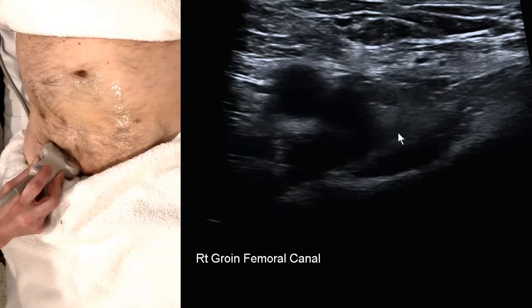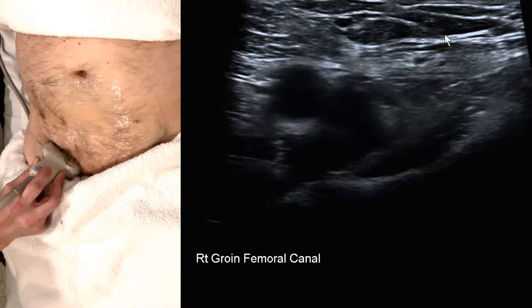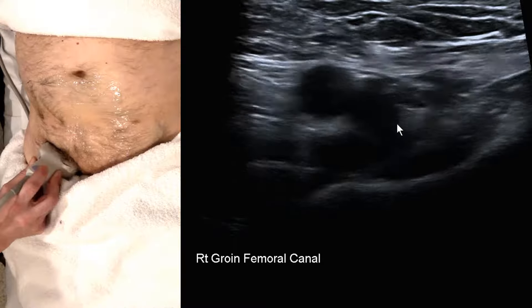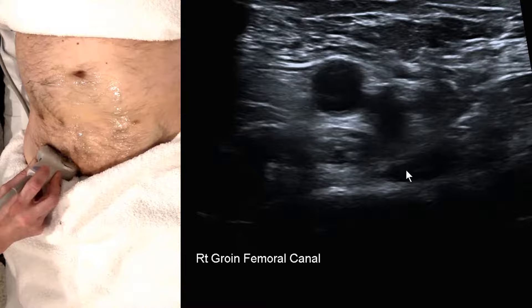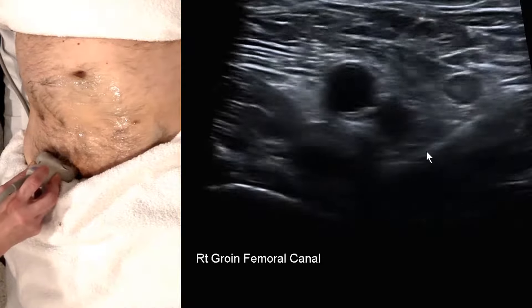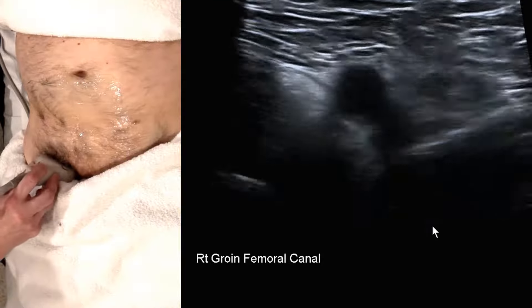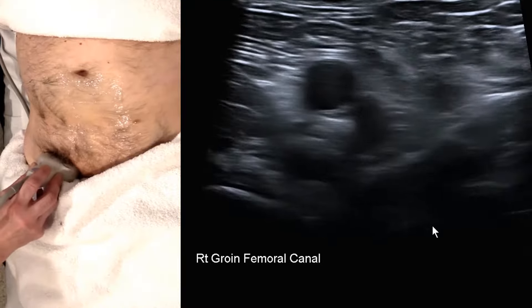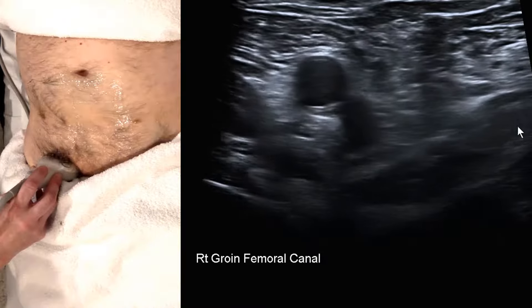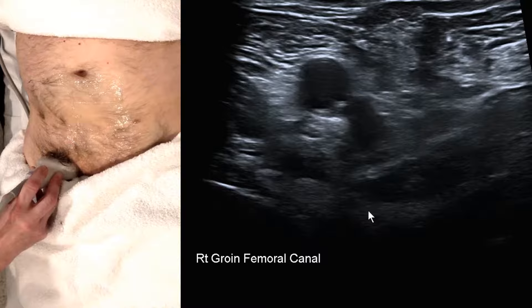We need to make sure we're not observing superficial to the inguinal ligament, because that would be the inguinal canal. Watching the area medial to the femoral vein and anterior to the pectineus, we should firstly identify the saphenofemoral junction (SFJ) and move down towards it, because if we're too high it can look like everyone has a hernia.